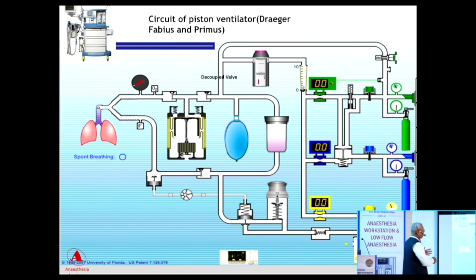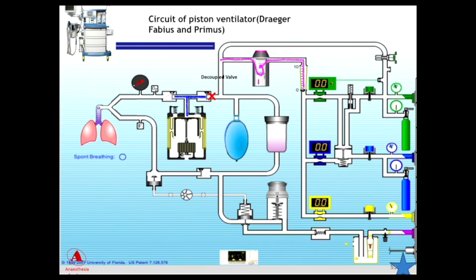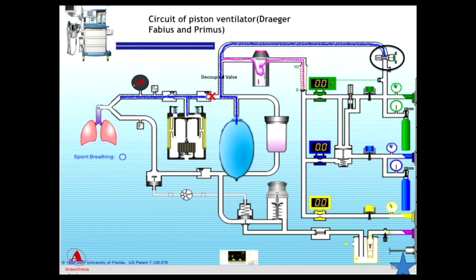So we'll again go back to this particular diagram. Okay. In this situation, this is a ventilator going on. Now here is a flush button. Okay, in this diagram. If you press flush, what will happen? The gas will not go to the inspiratory line. Tidal volume will not change. The only thing you get is a bigger bag, which we want.